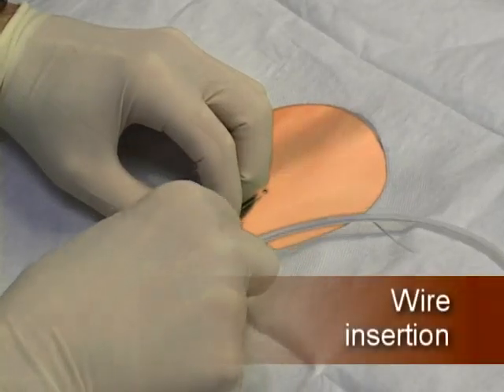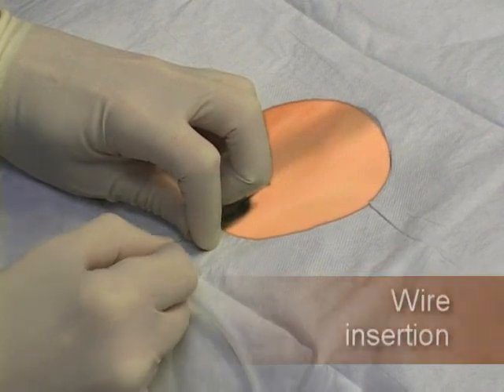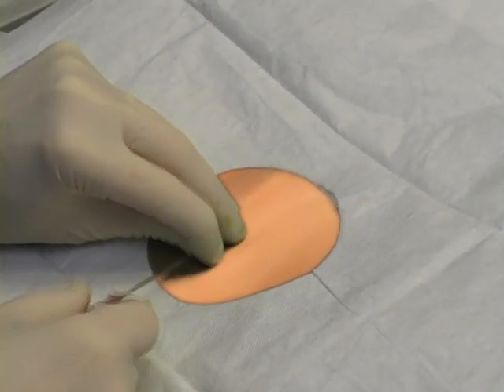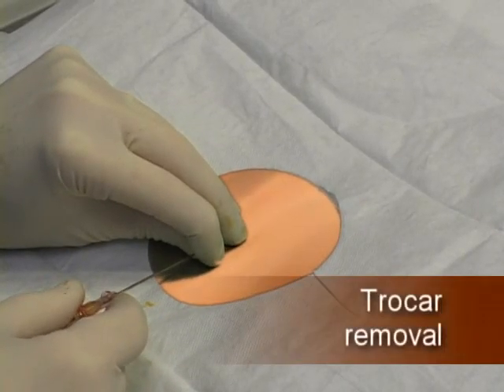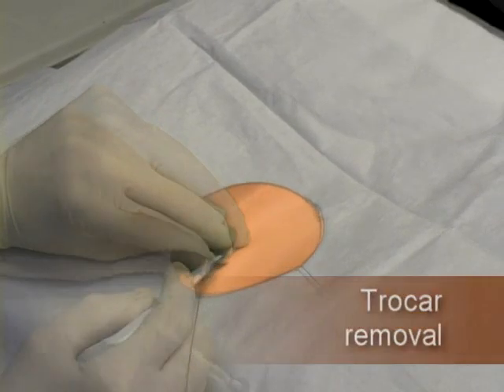Once this occurs, insert the wire through the trocar, taking care to use the thumb to prevent any air intake into the trocar during transfer as shown. At no time should the operator let go of the wire while it is inside the patient. Insert the wire at least 20 centimeters.